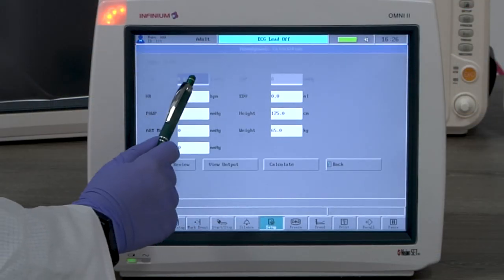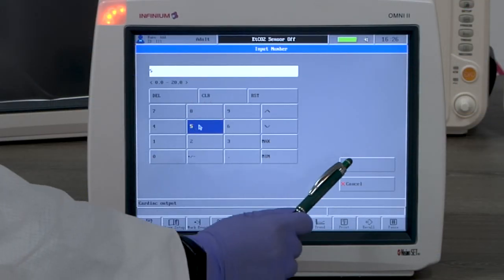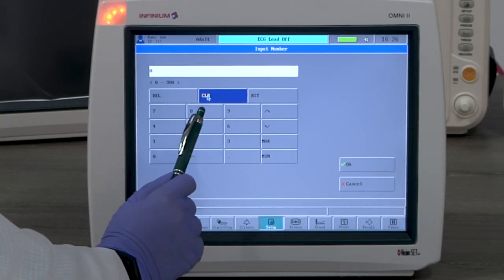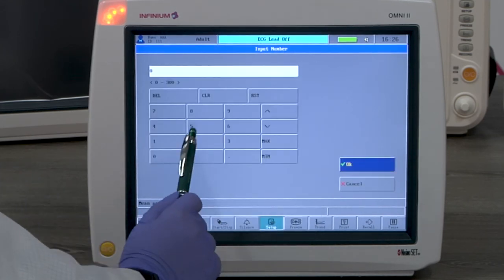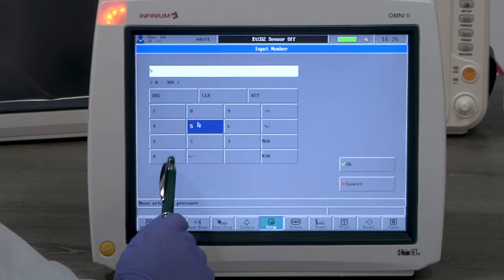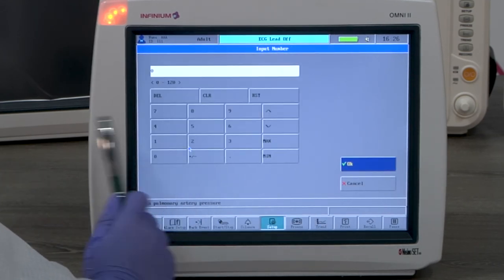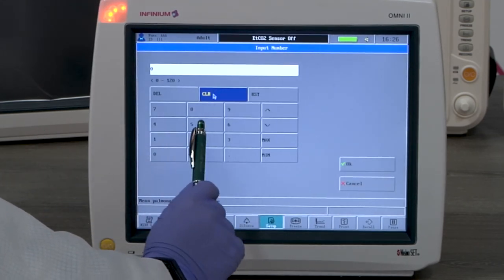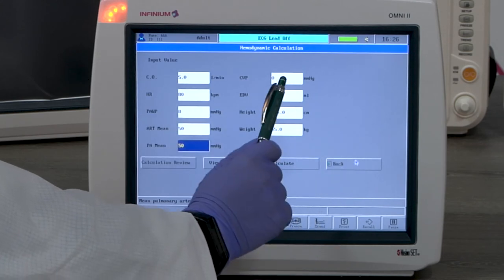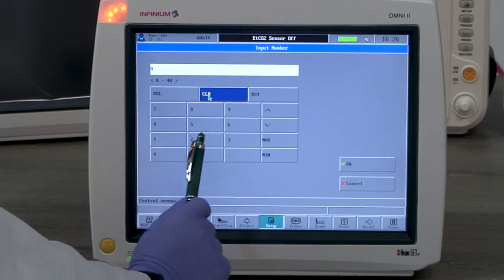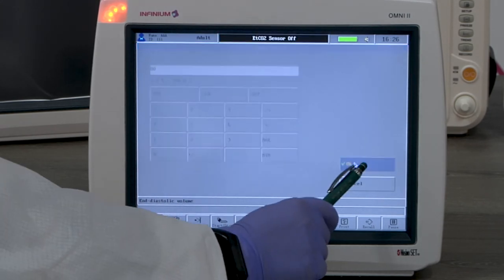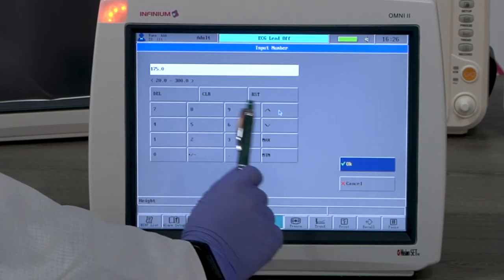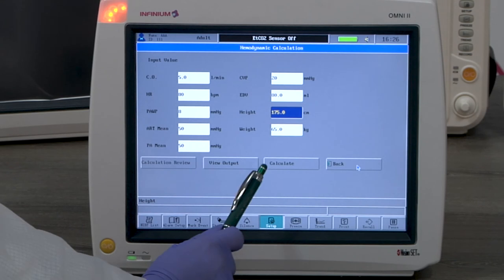Hemodynamic calculation is also a calculation feature. It will calculate most clinically relevant hemodynamic parameters. You only need to input all the required readings, then select View Output or Calculate to see the result.